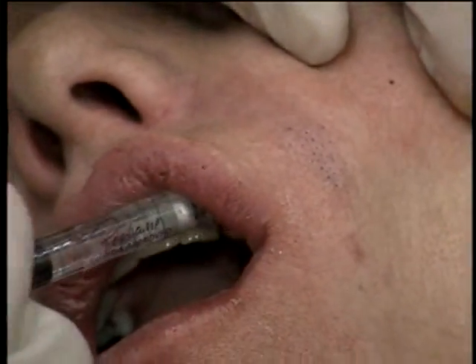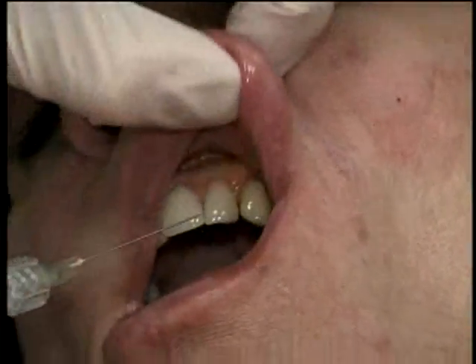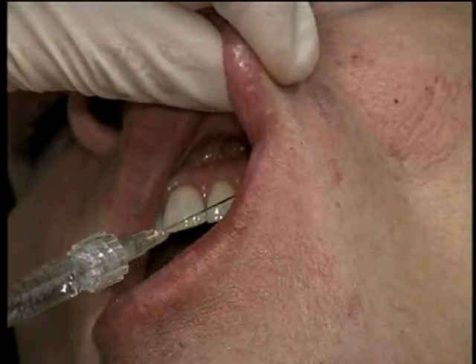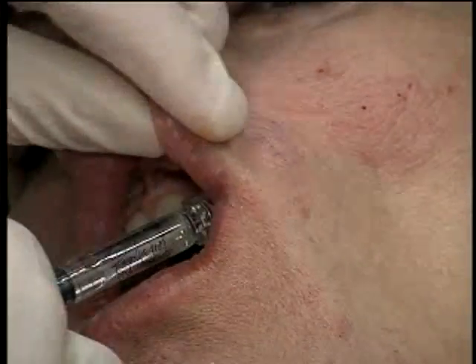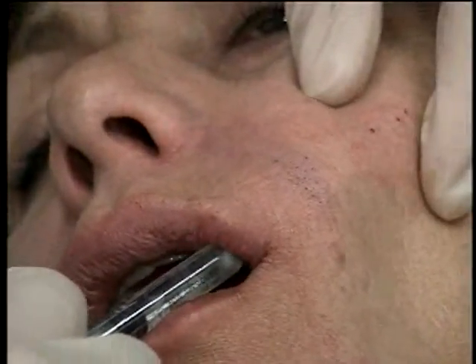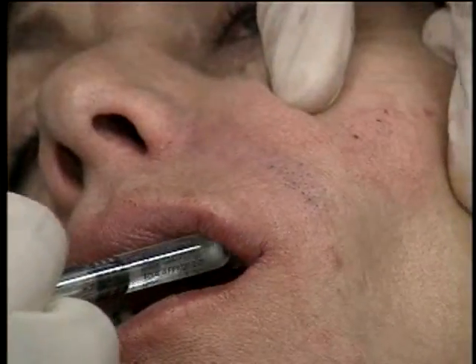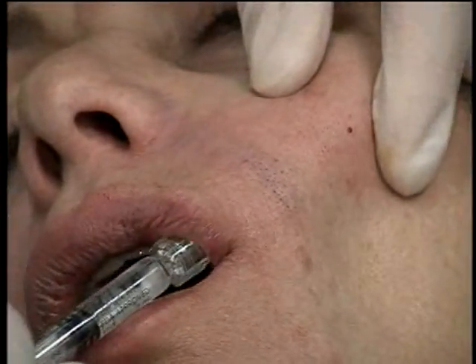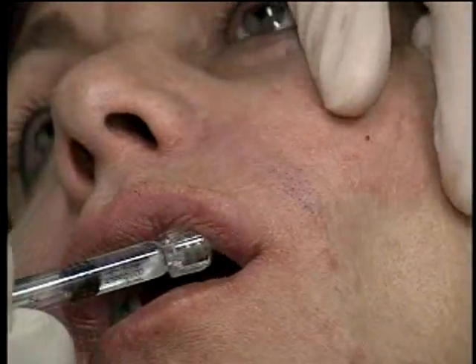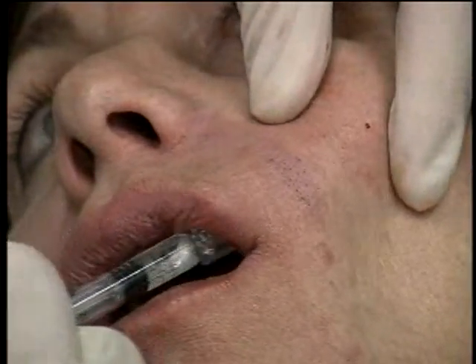And I'm injecting intraoral here into the area of concern. And my hands are here and I can feel the product being deposited. And this prevents a lot of the bruising and swelling. In addition, it's much less painful.